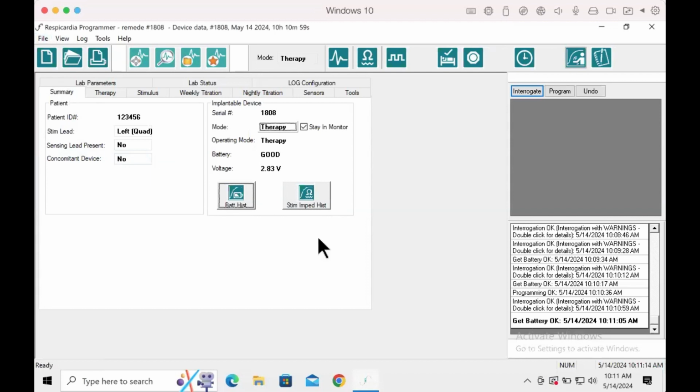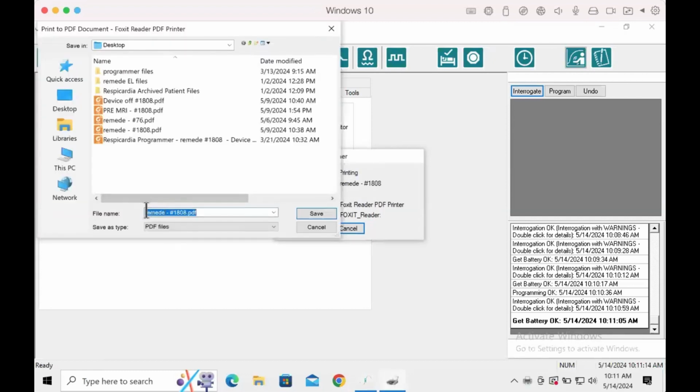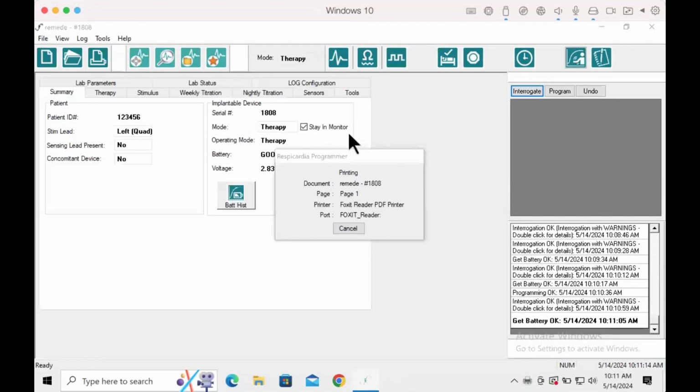Here are the considerations regarding various battery status and voltages. A battery status of good is a measured battery voltage level that is above the elective replacement indicator level. For the Remedy device, that is any battery voltage above 2.6 volts.